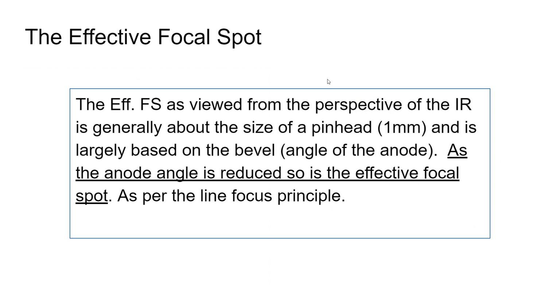Right. So if you make the effective focal spot smaller or the actual focal spot smaller, spatial resolution increases. And the spatial resolution increases because the focal spot, the effective focal spot, gets much smaller, right? It goes from around a centimeter, I think I have more exact numbers on the next slide, down to 10 times or more smaller. So we're at 1 millimeter, right? And that's with the large focal spot. So let's get to the next slide, which has better numbers.